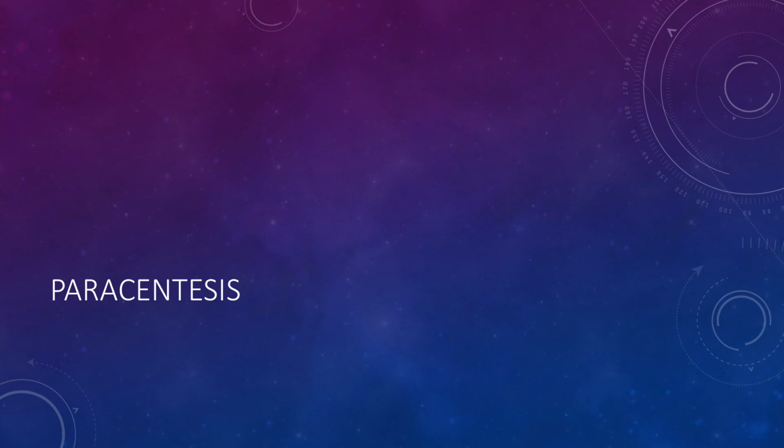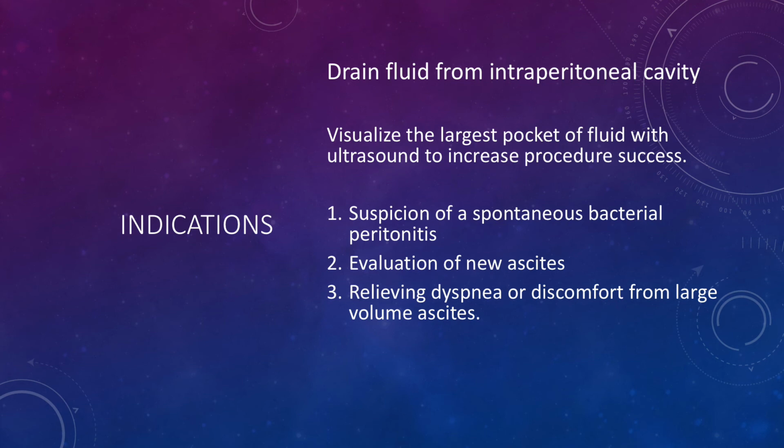The last procedure we're going to review today is paracentesis. Indications for this procedure are to drain fluid from the intraperitoneal cavity. You'd like to visualize the largest pocket of fluid to increase success. This is usually done when we're suspicious for SBP, for evaluation of new ascites, or for relieving shortness of breath or discomfort from large volume ascites.